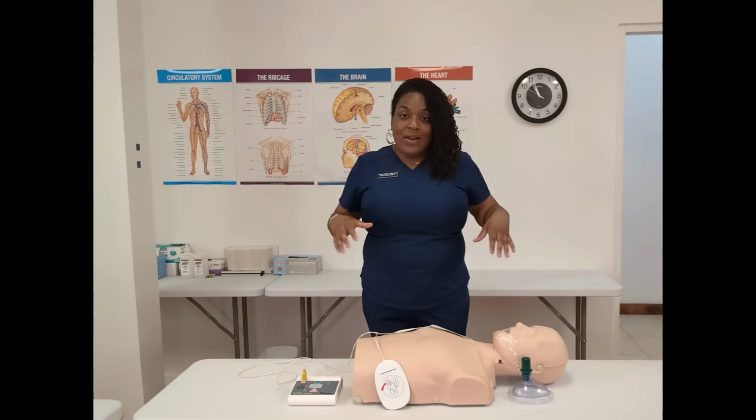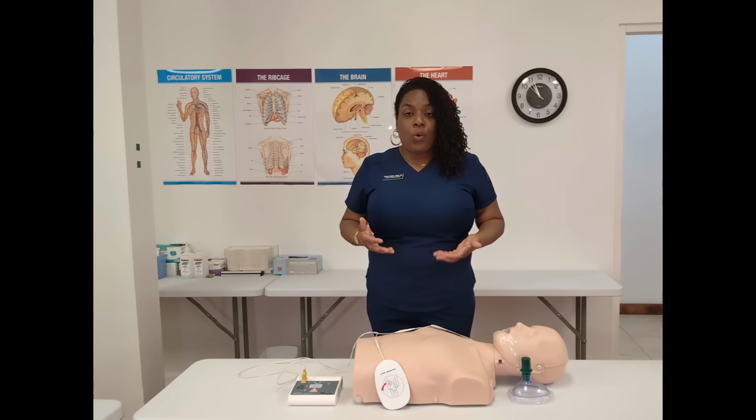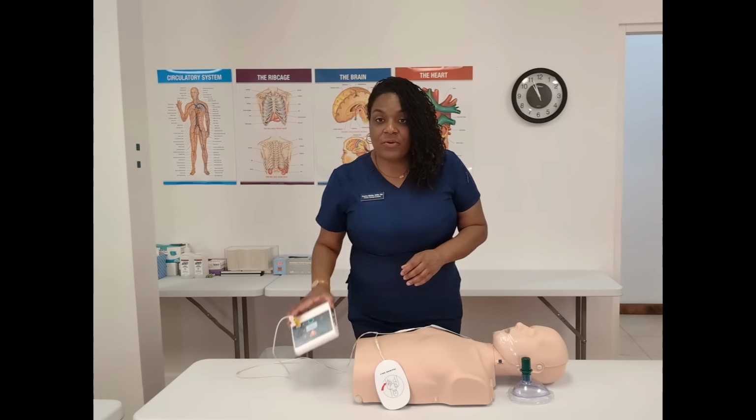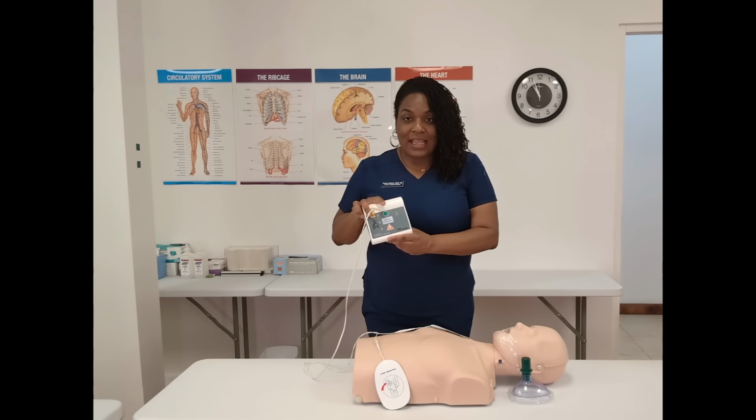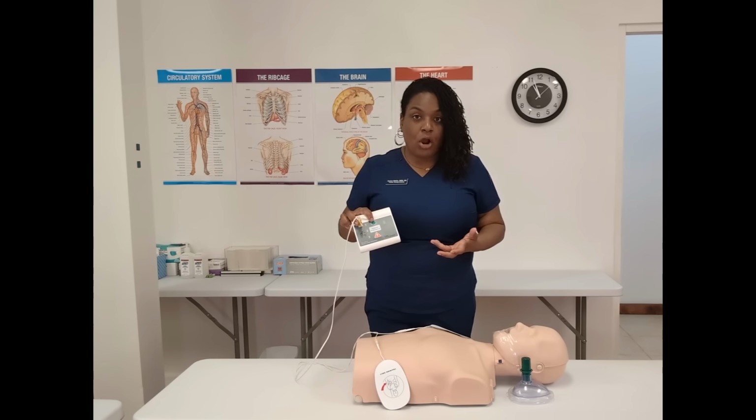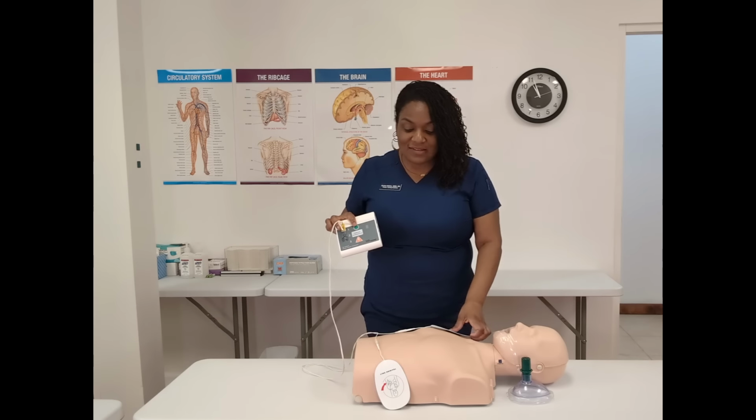So once we clear it, it analyzes, and it's going to let you know whether or not a shock is required. And if a shock is required, there's going to be a light that flashes. When that light flashes, you press it, just make sure no one's touching first, and then you go right back into your compressions, because there is no residual charge, any energy that's left over that can harm you. All right, so we talked about it, let's actually perform it.